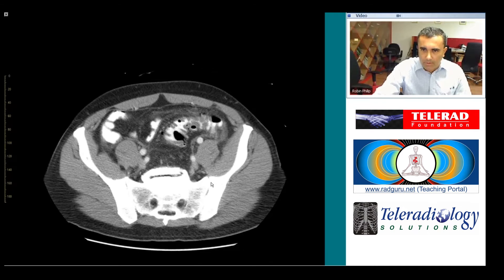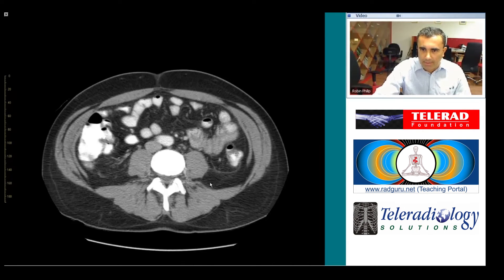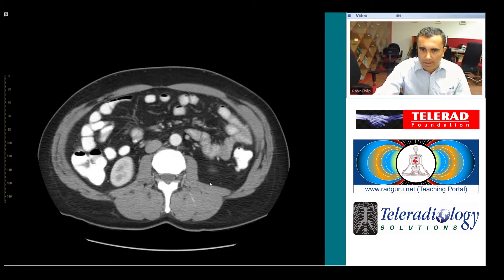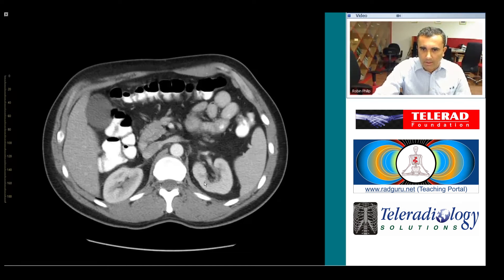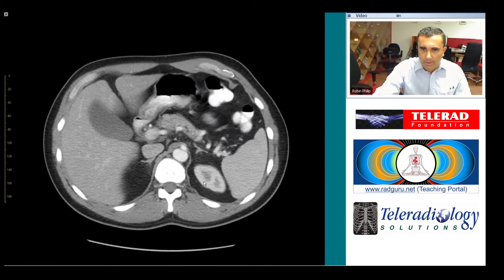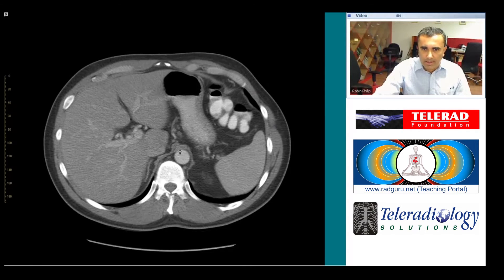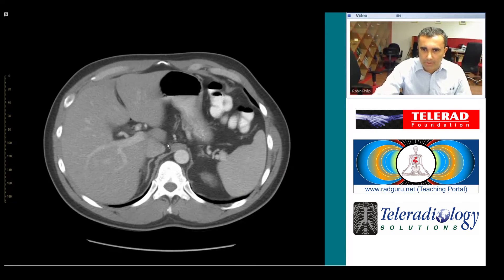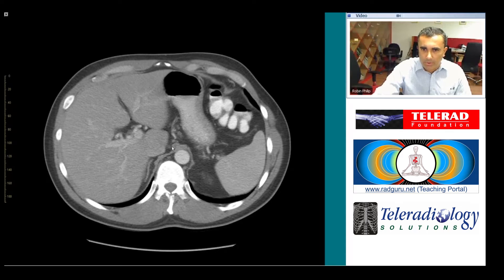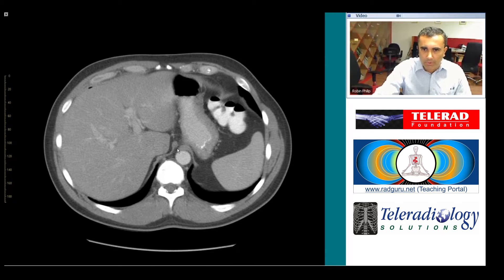Moving up into the abdomen, we encounter a loculus of air in another very typical location, right here in the fossa hepatis, near the fissure for the ligamentum venosum. This is the place that one must always remember to look for free air.